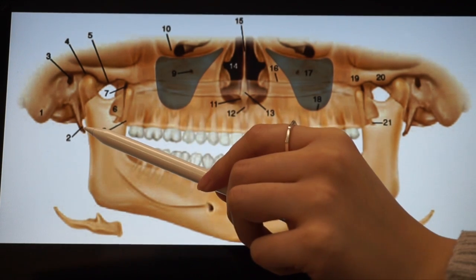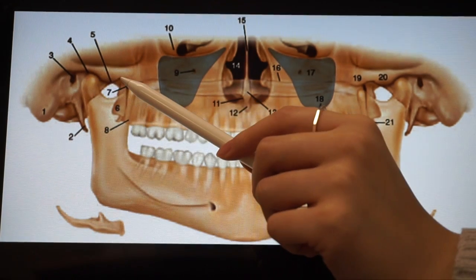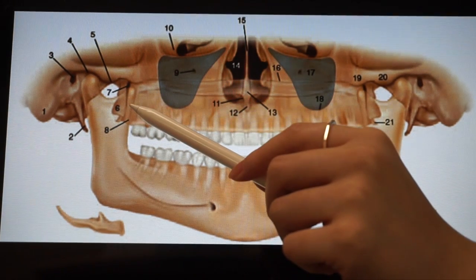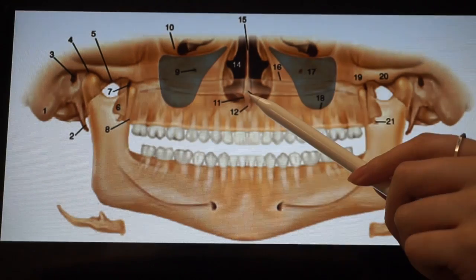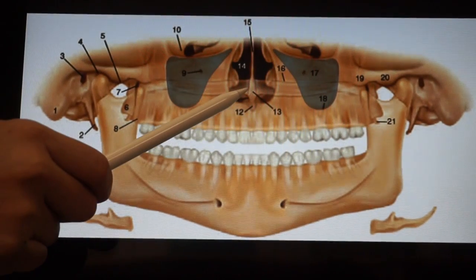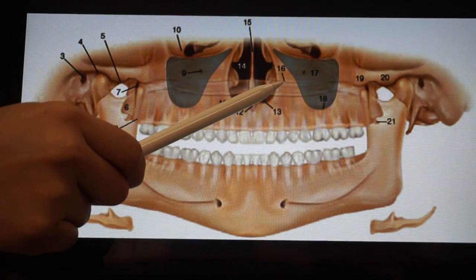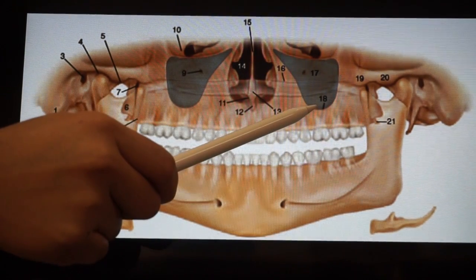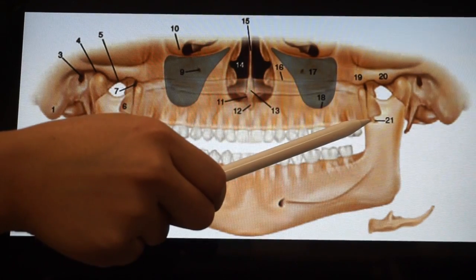Hey Jeopardy, this is your final question. Today we'll be focusing on the maxillary landmarks on a pan X-ray. So pay attention. Mastoid process, styloid process, external auditory meatus, glenoid fossa, articular eminence, lateral pterygoid plate, maxillary tuberosity, infraorbital foramen, orbit, incisive canal, incisive foramen, anterior nasal spine, nasal cavity and concha, nasal septum, hard palate, maxillary sinus, floor of maxillary sinus, zygomatic process of maxilla, zygomatic arch, hamulus.